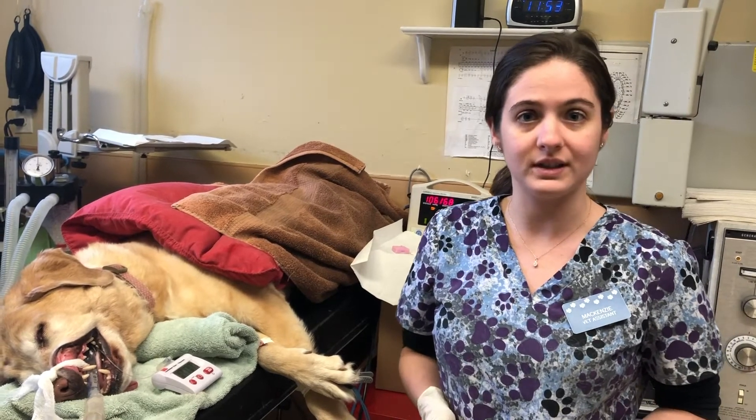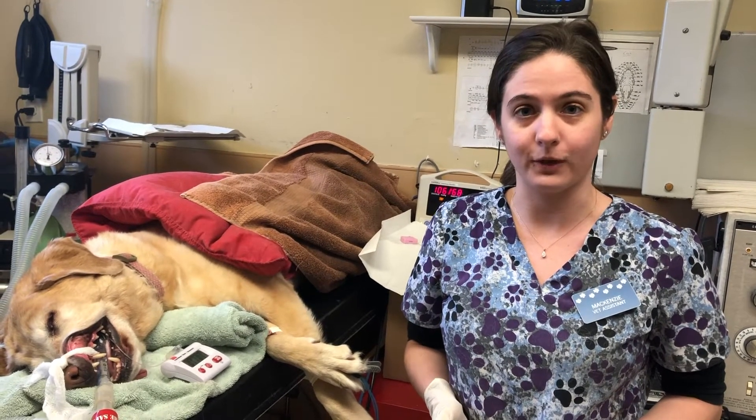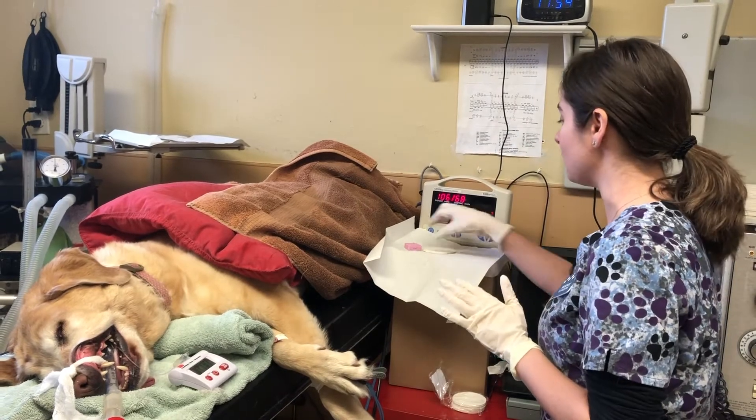This test is used to detect abnormal maladies in platelet function, and these are the tools I'm going to be using.